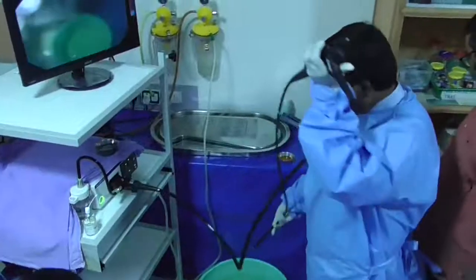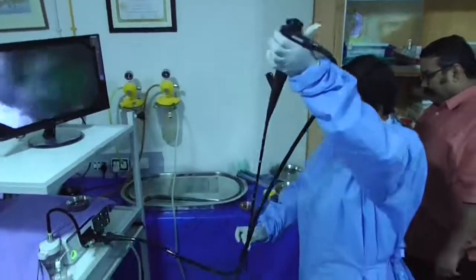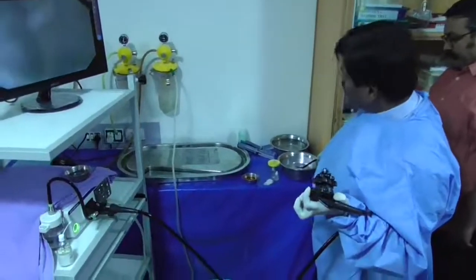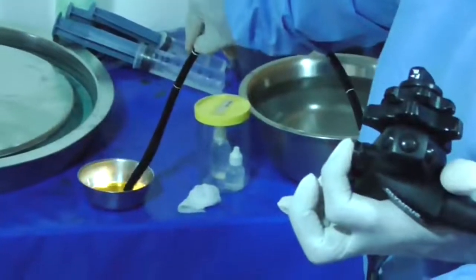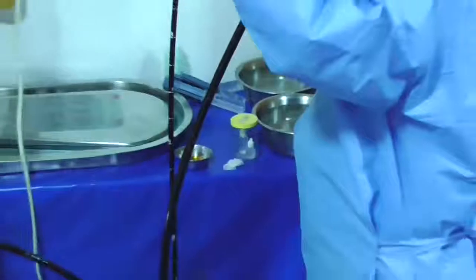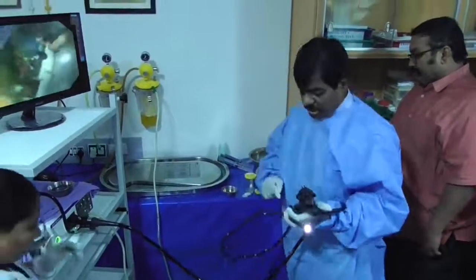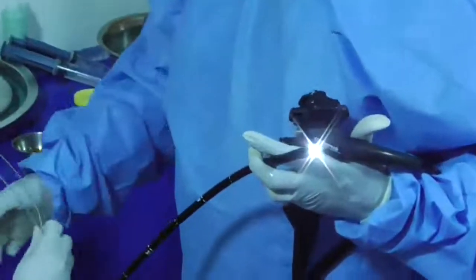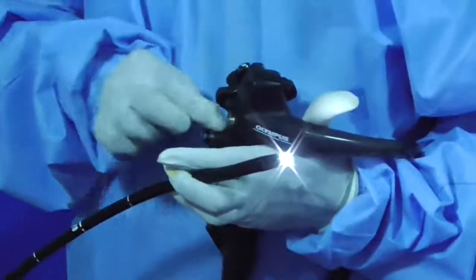With the uvula at the 2 o'clock position and the soft palate at 6 o'clock, take the scope out. Then do what we call pre-cleaning: externally wipe the whole scope, suck all the saliva and fluid — around 200 ml — then flush about 10 to 20 ml of antiseptic and wipe the outside with antiseptic. Next, put a brush through the access channel and also the suction channel — a brush is used as seen here.